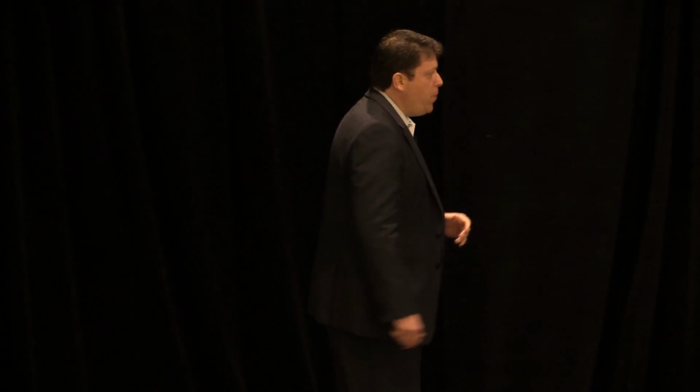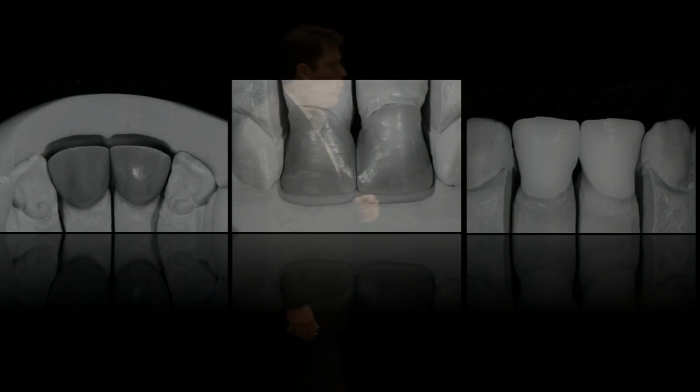The provisionals give us not only aesthetic information for the design of the restoration, but also, if you look at the palatal aspects of the provisionals, the functional aspect of that restoration. And so all those items have to be evaluated and discussed carefully, and eventually, once everything has been designed to the ultimate, translated to the definitive restoration.